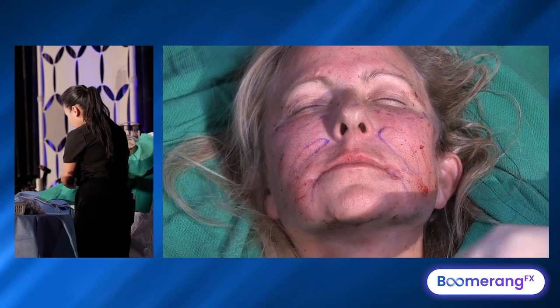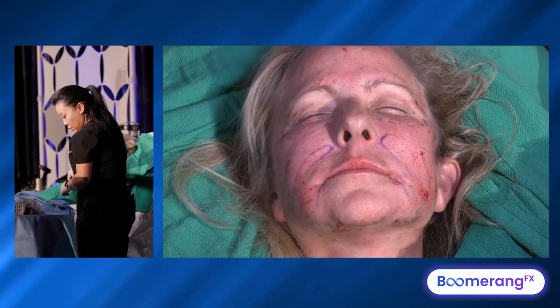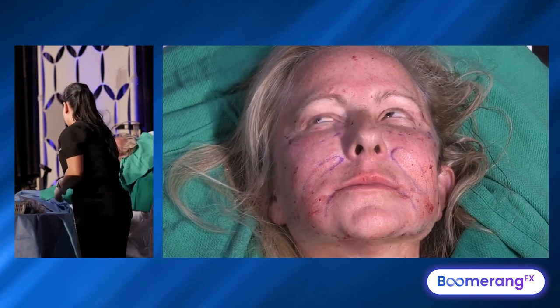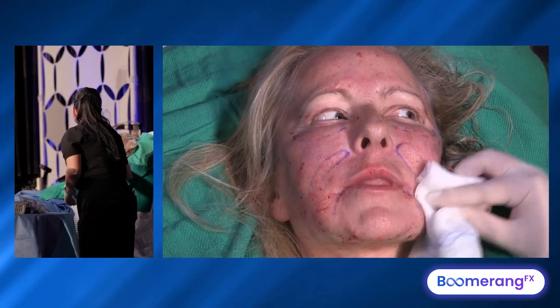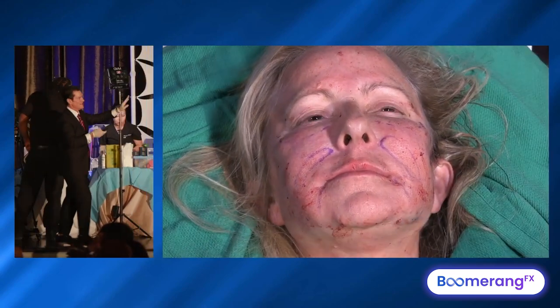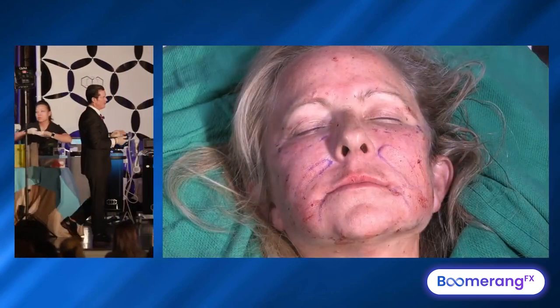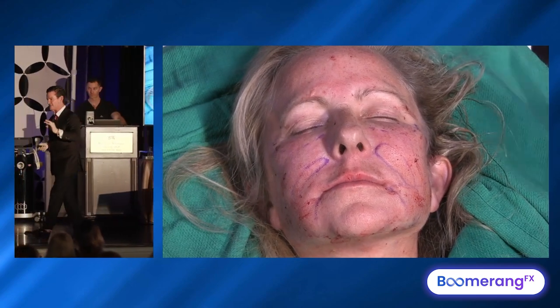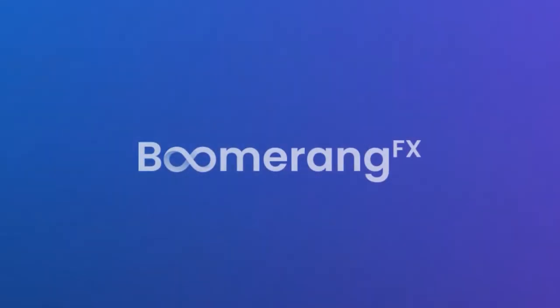11 syringes, but it didn't seem like a lot in any one area — just a lot of areas. To take her face from this to that. We uncoupled her brow, we did her RF, and we're missing one last thing. The last thing we're going to do is elevate her face and put a cast on that structure until it heals.